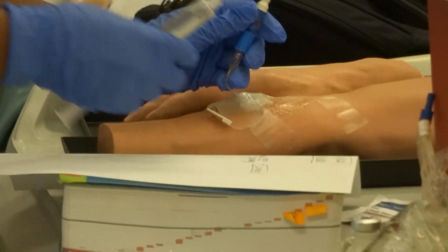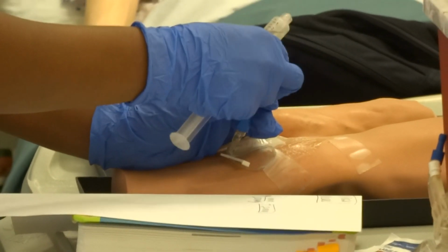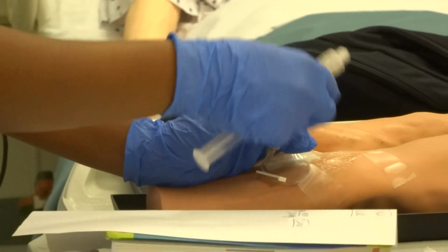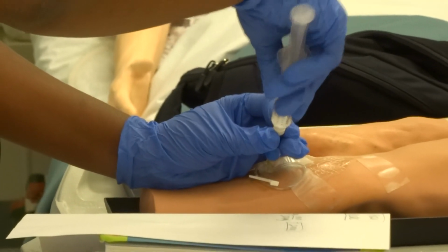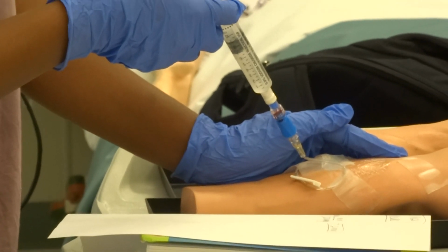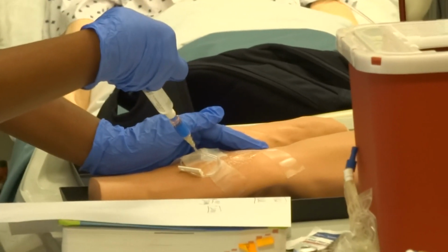Okay, so I pushed all of my Lasix for this patient. I'm scrubbing again with the new alcohol swab, by the way, for 20 more seconds. And then I can go ahead and flush with the remainder 5 mLs. Should I just push this really fast? Does it matter how long I push it? Same rate as the medication, right? So again, 2 minutes, I'm gonna push this entire thing.